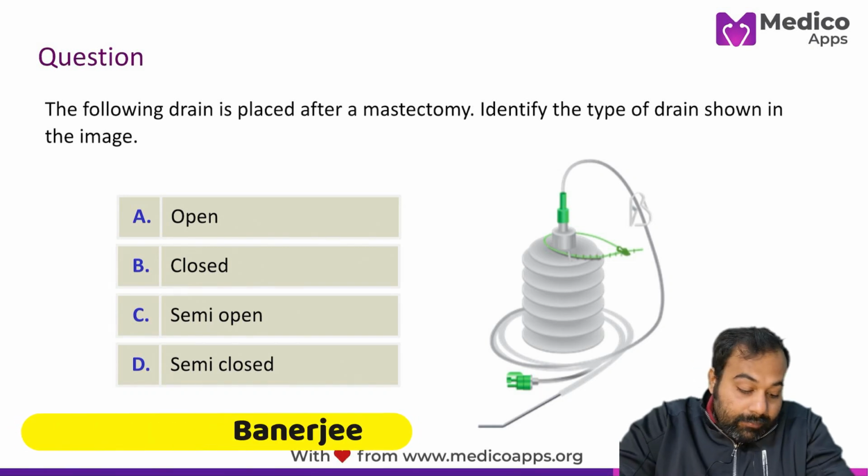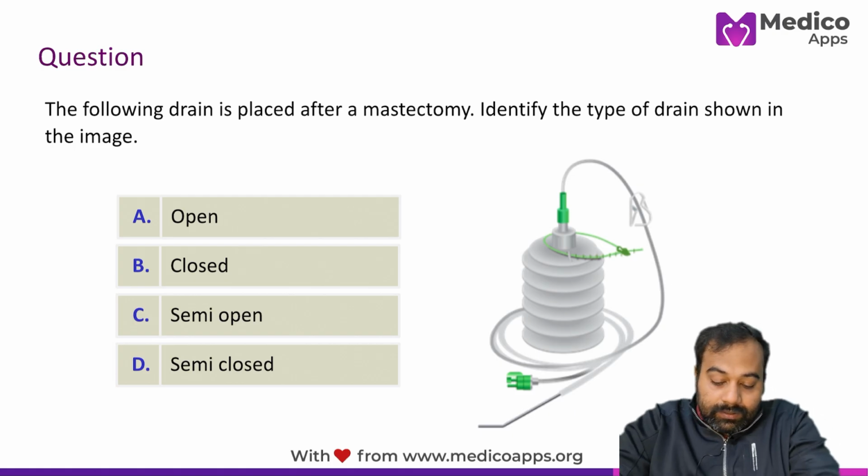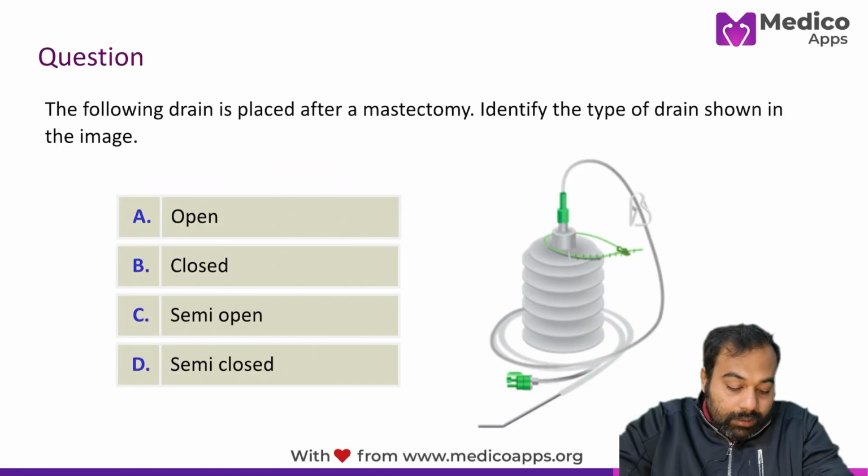Okay, our next question: the following drain is placed after the mastectomy. Identify the type of drain shown in this image. You can easily see this image, right? Now the options are open, closed, semi-closed, and semi-open.